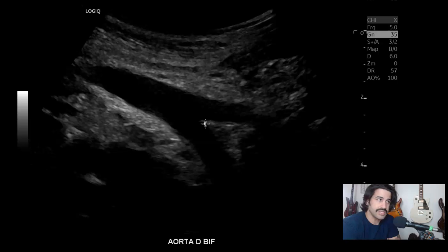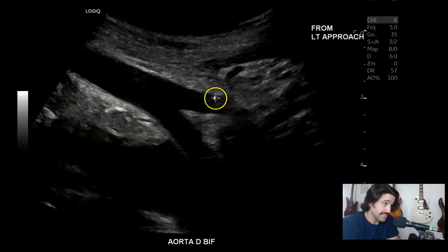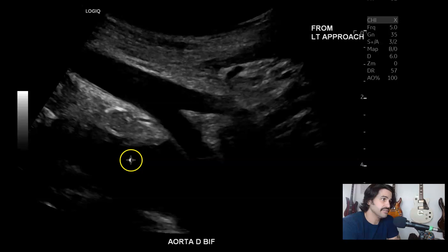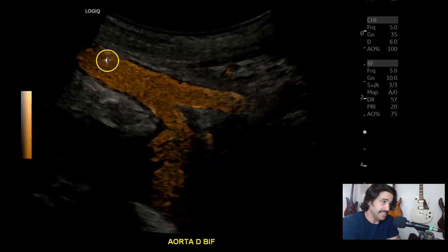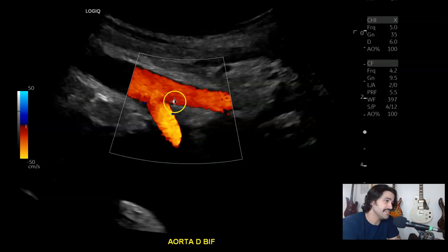Depending on what side you're approaching from — I'm approaching from the left, so I was wrong. This is the left common iliac artery and this is the right common iliac artery. This is the B-flow hybrid mode, so it's B-flow on top of grayscale. This is very good — if you have any stenosis, I've had patients with stenosis of the inferior mesenteric artery that this showed very clearly. A very good mode to have.